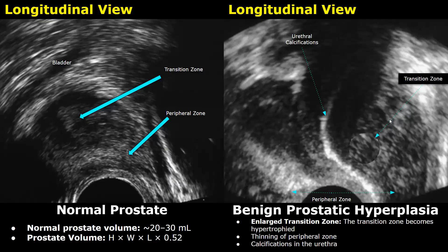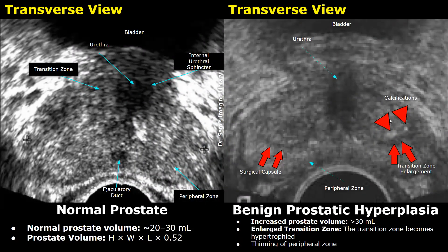This is an image showing a normal prostate. This echogenic area is the peripheral zone, this hypoechoic area is the transition zone, this central hypoechoic region is the urethra, and up here is the bladder.